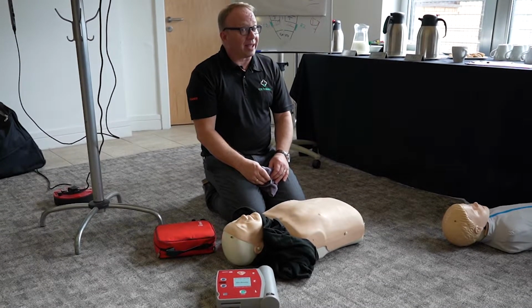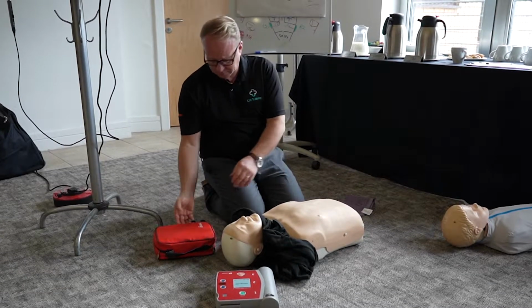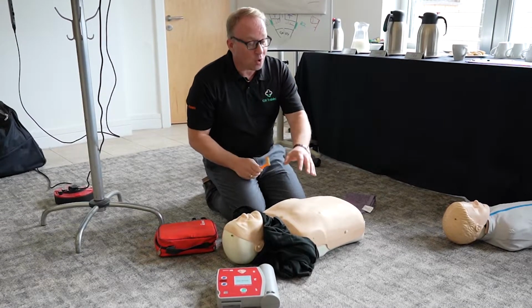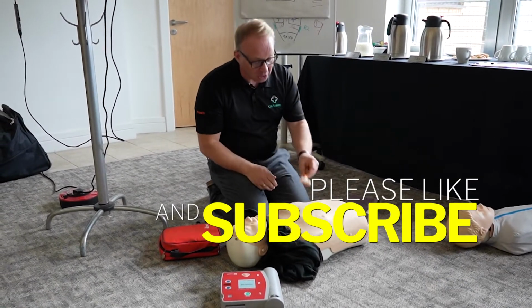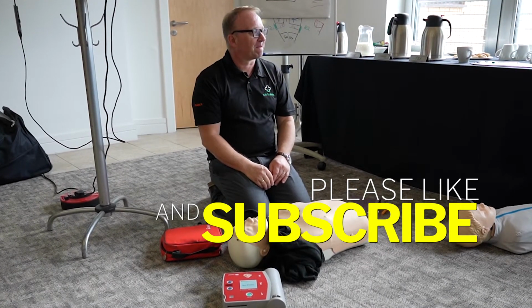What if they're very hairy? Do you have to shave them? You do. Of course you have to shave them, but you only shave them in the place where the pads go. You don't have to shave the whole body, you'd be there all day. Anything else? What else?